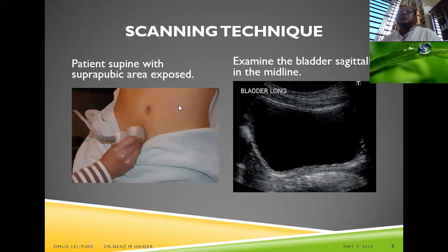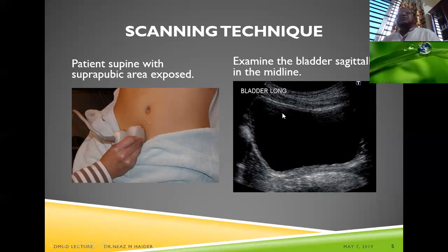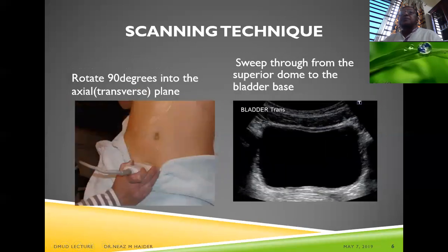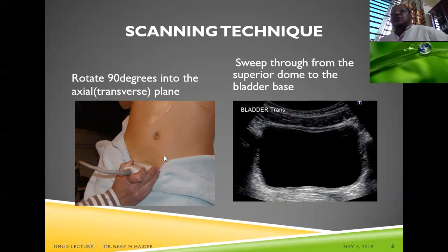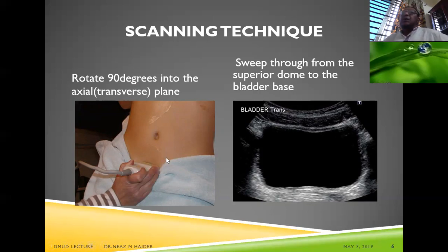With the patient lying supine, we place the transducer in the longitudinal plane to obtain a long-section view of the urinary bladder. We then rotate the transducer 90 degrees to obtain the axial or transverse plane — the short section. In every ultrasound examination, we scan in at least two orthogonal planes to increase our diagnostic confidence.